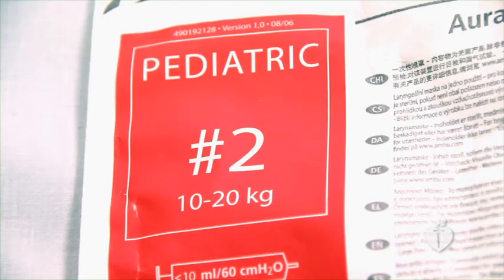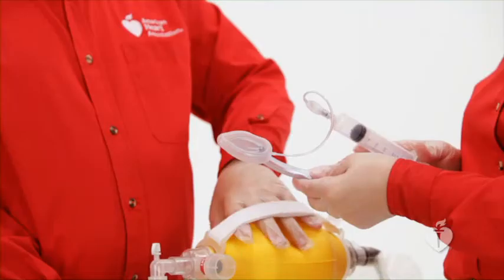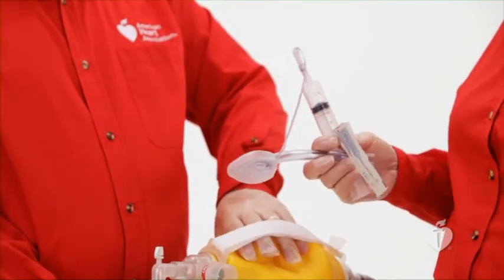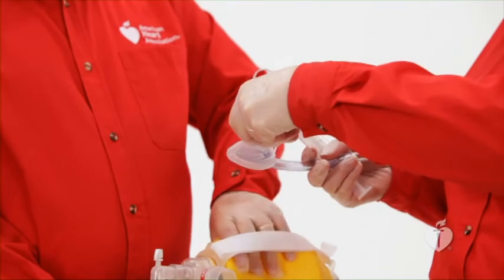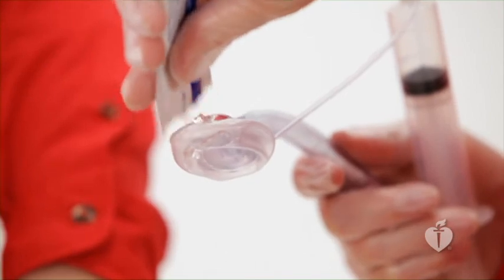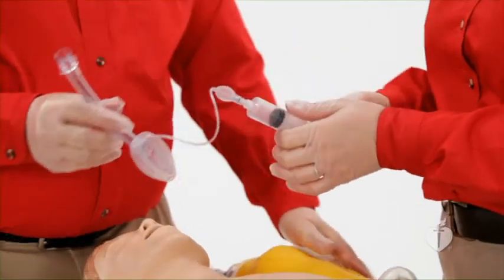For example, use a size 2 laryngeal mask airway for a child who weighs 10 to 20 kilograms. The maximum amount of air recommended to inflate the cuff is also noted on the package and the device. Before using the airway, read the manufacturer's instructions and ensure that the mask inflates properly. Then, partially or completely deflate the mask based on operator preference. Lubricate the mask with a water-soluble lubricant. Open the mouth and insert the airway.